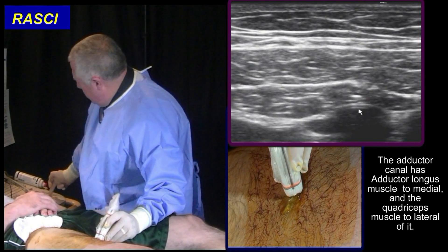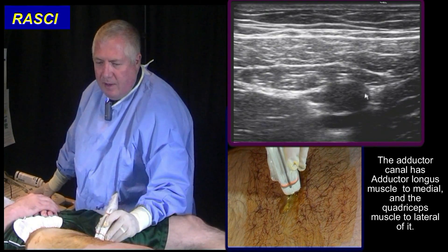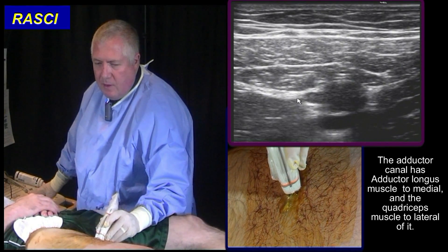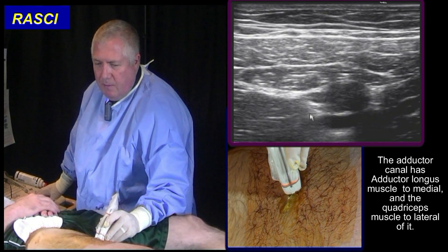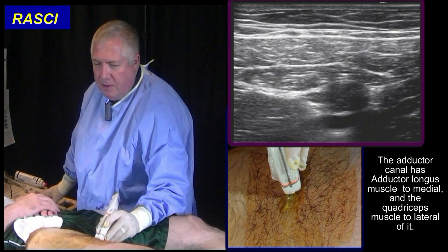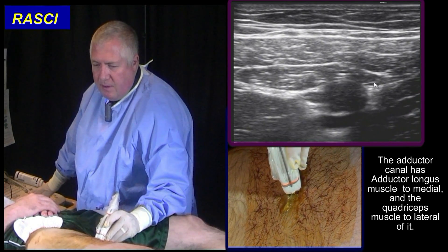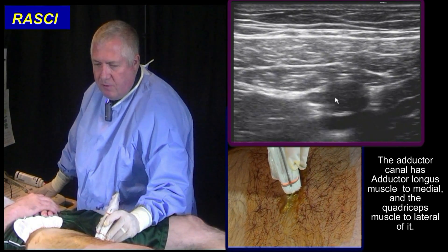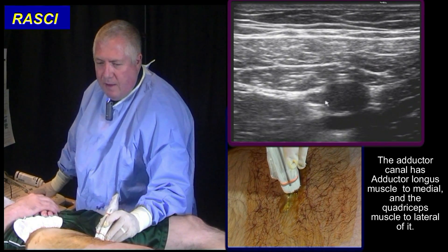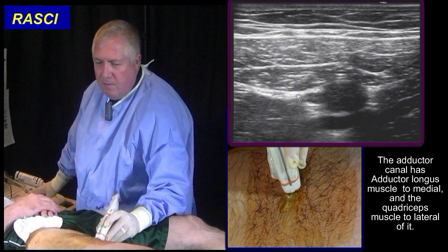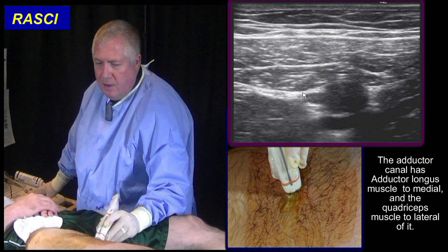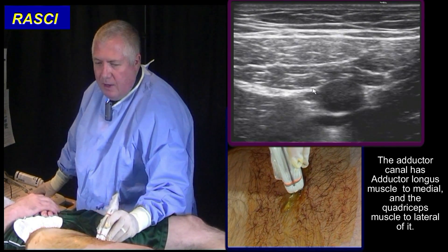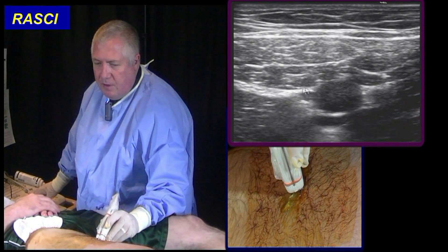The adductor canal itself is technically this space under this muscle, around here. We see a vein, we see the artery, and the saphenous nerve lies lateral and above that artery.